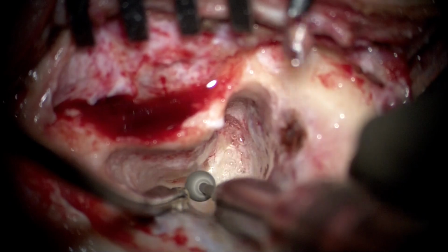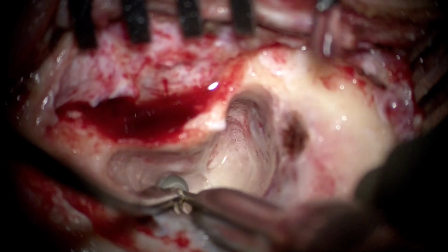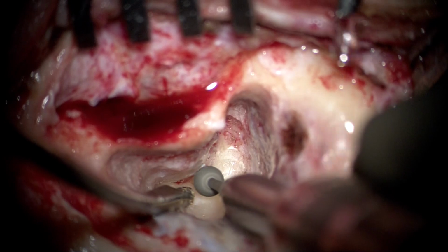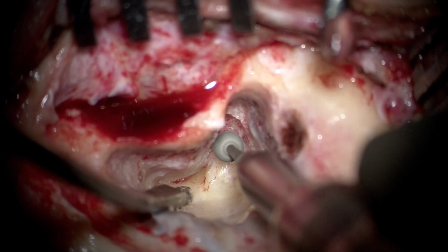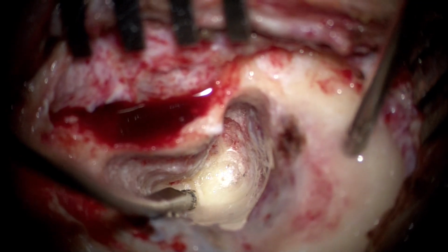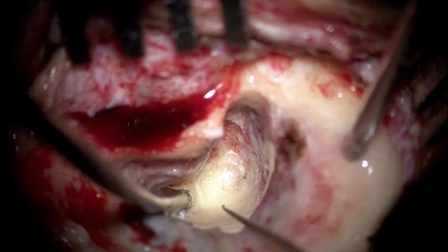So a small amount of bone over the lateral lip of the vestibule is now being drilled for us to be able to get a look inside the vestibule from posteriorly. This is the same step that I was cautioning against. One has to be careful in this step. It has to be done with a lot of irrigation and with the drill constantly moving so that we do not touch or contact the second genu facial nerve fibers.